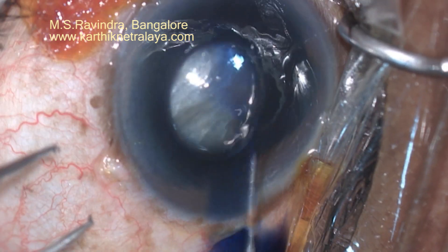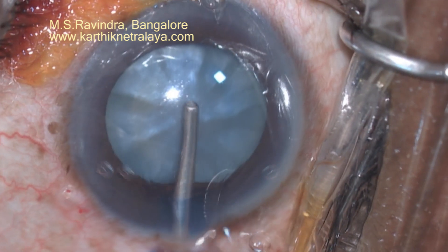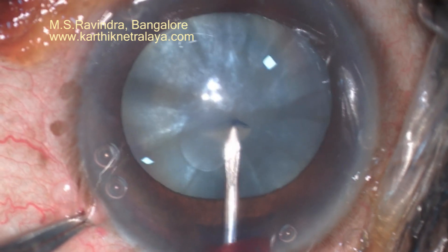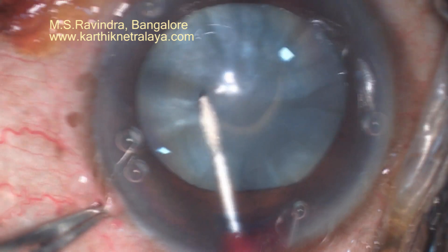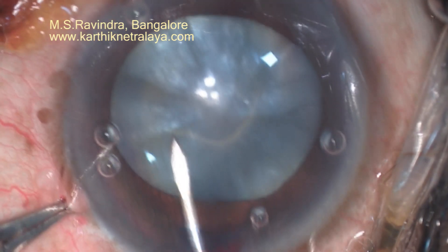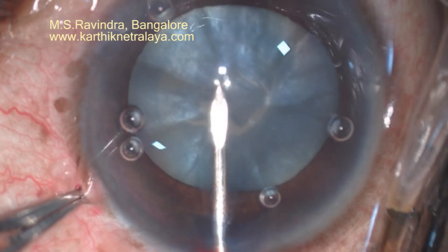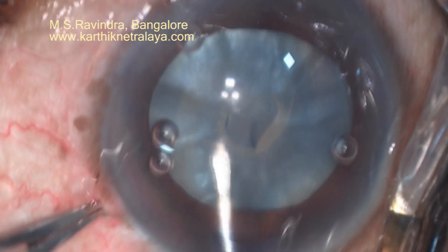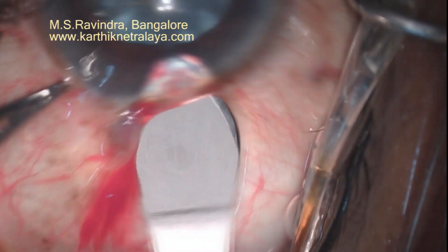Another case: air and trypan blue applied, chamber deepened with viscoelastic, tunnel floor entry. A small nick in the capsule — some fluid comes off and I'm unable to complete the rhexis. What I'm doing is joining the half rhexis by making a couple of can-opening incisions in the capsule on the distal side. Free the capsule and stir the cortex a little bit so that you get a certain amount of hydrodissection into the capsular bag. Be careful not to enlarge the flaps you've created to the periphery; enlarge the tunnel.